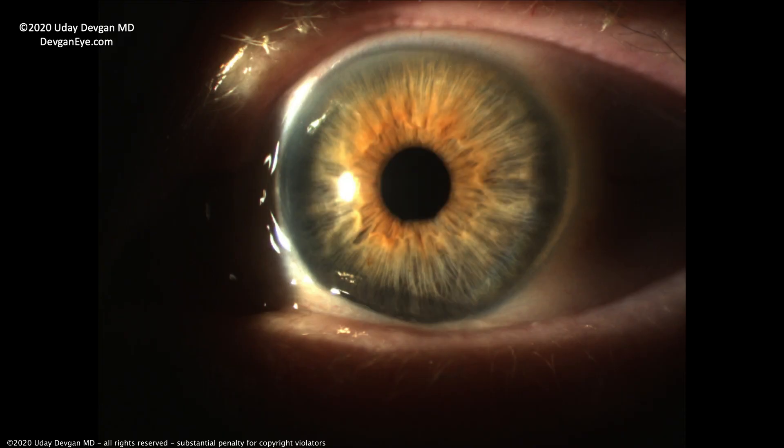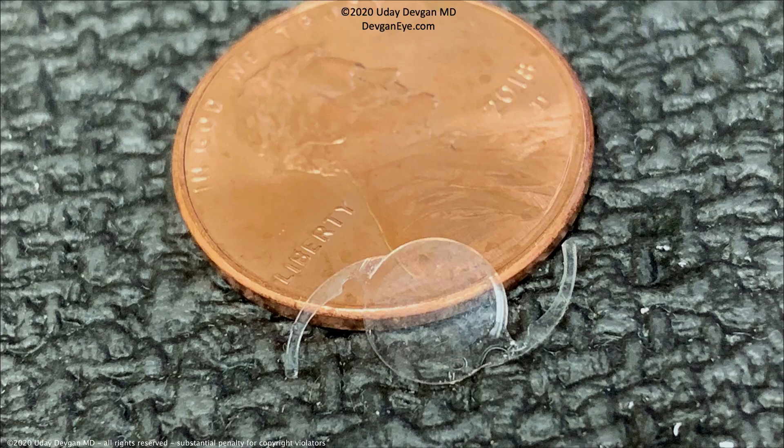This is a once-in-a-lifetime surgery. You do cataract surgery once and it's good for the rest of your life — it does not have to be repeated in the vast majority of cases. This lens implant is tiny; look at the size compared to a penny. It's about 6 millimeters for the round optic, about a quarter of an inch in diameter. These are all made in the U.S. to the highest standards and optical quality — I don't use any generic or cheap implants. For the best vision, you need the best implants.